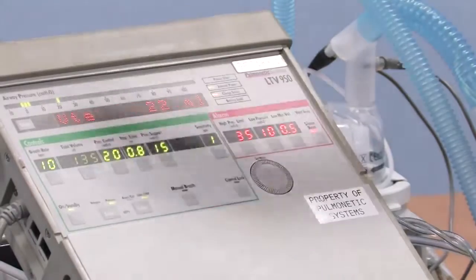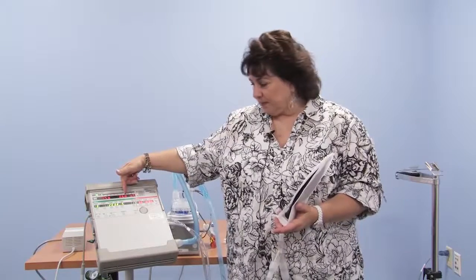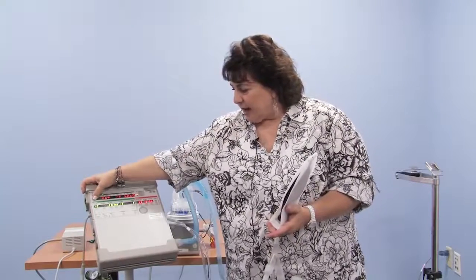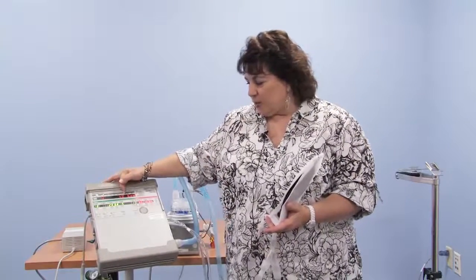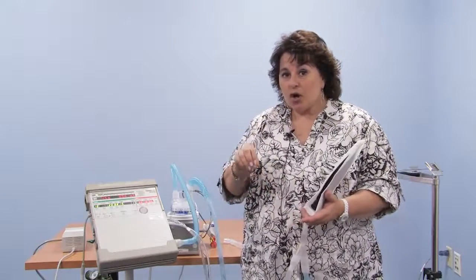So now you're thinking, well, this is kind of crazy. How am I going to leave my child and not know if the trach tube is plugged? There is a third alarm, and it is, for some people, a little hard to grasp how it works, because you're not respiratory therapists and this isn't what you've been doing for your life. But what the machine does is it looks at the size of the breath, VTE, and the next number it looks at, the F, how many breaths. So it looks at how many breaths and the size of the breaths in milliliters, and it constantly extrapolates that out into a figure that it looks at, and it's called minute volume.